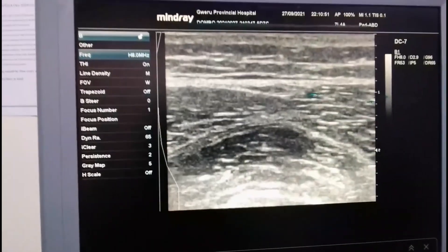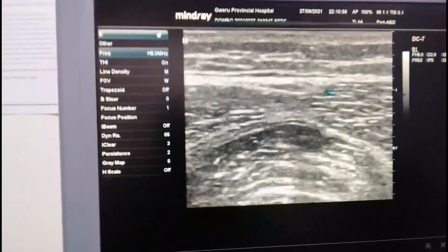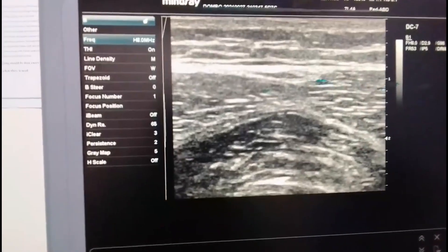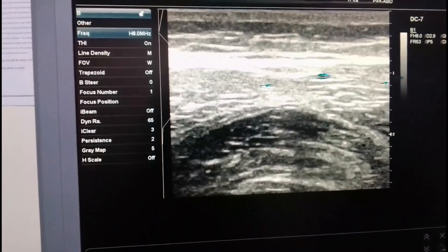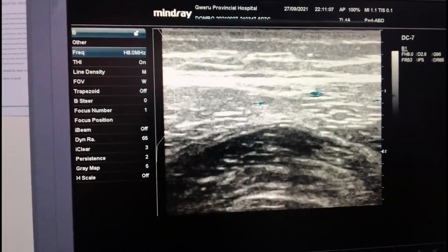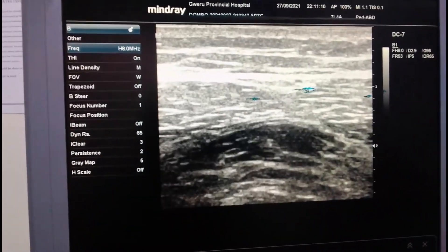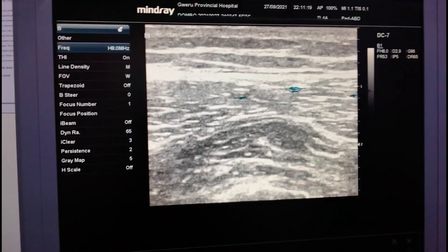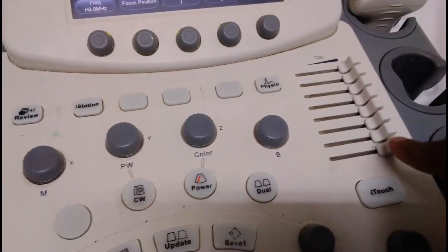As I move the keys further, it is becoming more bright, and you can see there is an aspect here that is becoming dark. The effect is actually increasing as I do it this way. I am now moving the upper keys and you can see it is becoming bright. So let me move back the keys below — that hypoechoic lesion-like structure is disappearing. I have aligned the keys straight and see how the image is looking — it is now more homogeneous.